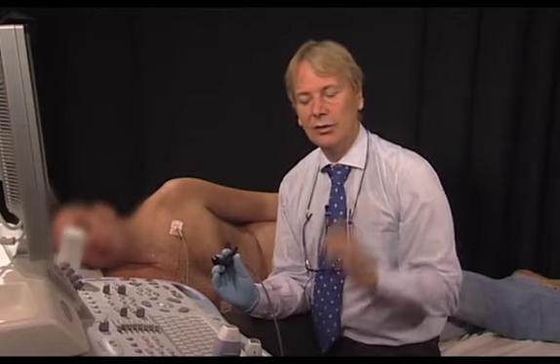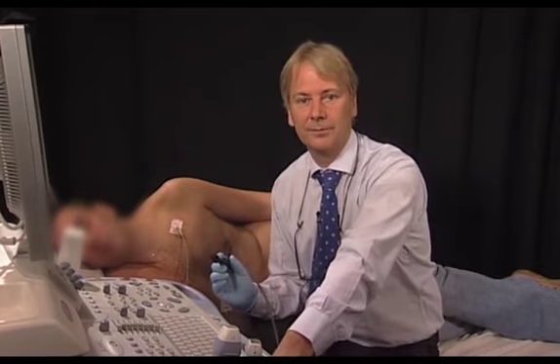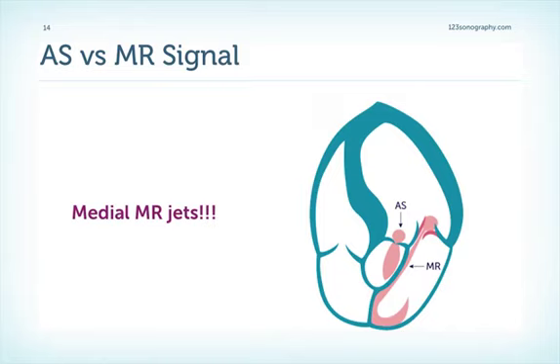So, in conclusion, very important, first to put the patient in a right position as far as possible. Second, to listen to the signal, small motions, and to try more than one transducer position. There are some pitfalls. Aortic stenosis and mitral regurgitation signals can sometimes be mistaken. So watch out especially for medial MR jets. Because they have the same direction, you can sometimes mistake them, as both are, of course, systolic jets.